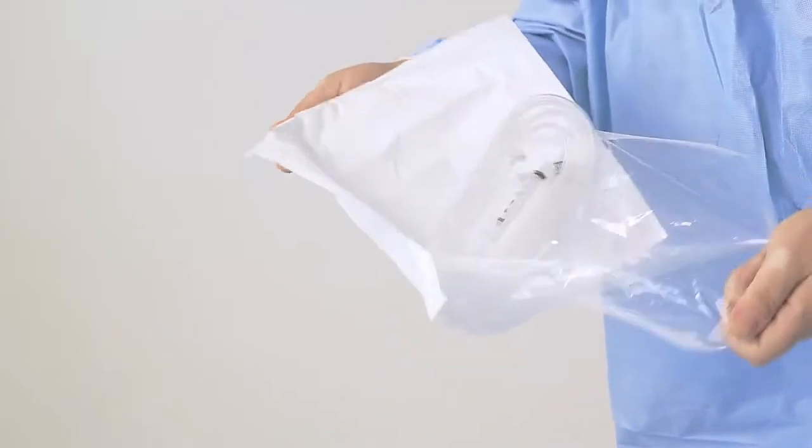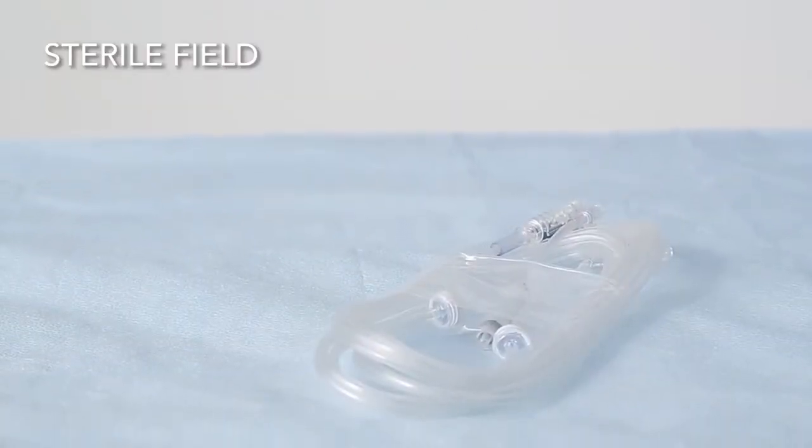If undamaged, open packaging in a sterile way and offload the contents of the pouch into the sterile field.